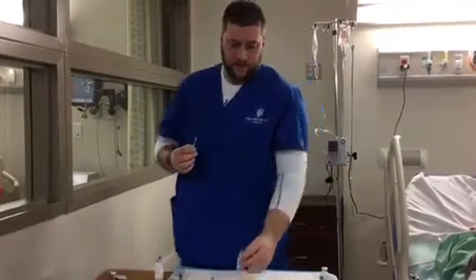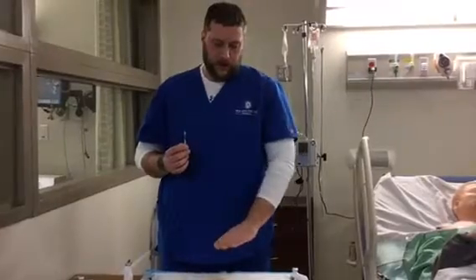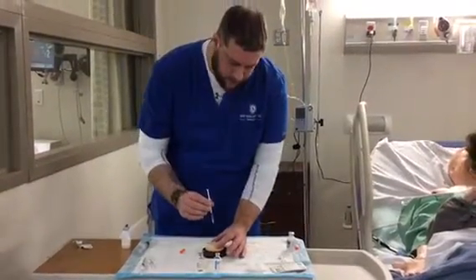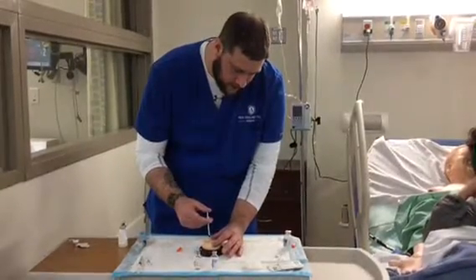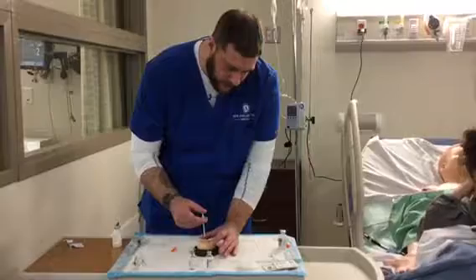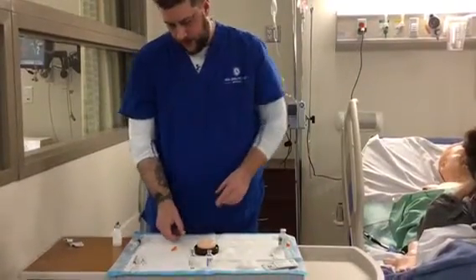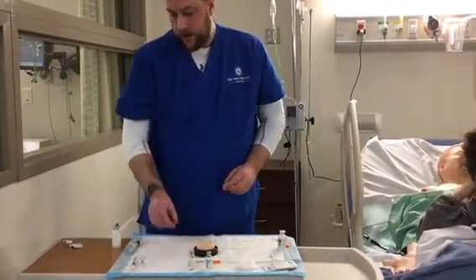Withdraw. At this point, it's going to be the same as the intramuscular. You're going to clean the site, wait 20 seconds, and again, going taut, straight in, inject, relax, and straight out. Again, you would not recap, you would dispose of it in the correct location.